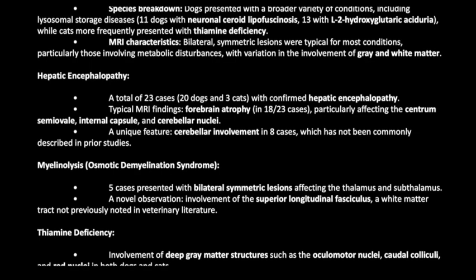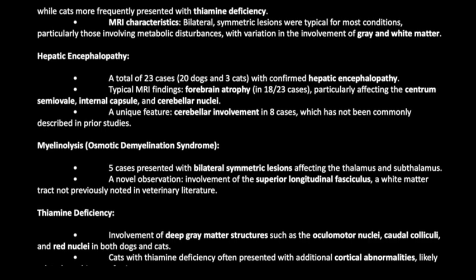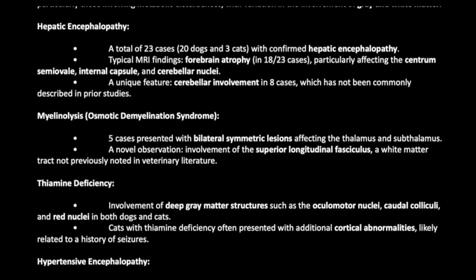Myelinolysis, osmotic demyelination syndrome. 5 cases presented with bilateral symmetric lesions affecting the thalamus and subthalamus. A novel observation: involvement of the superior longitudinal fasciculus, a white matter tract not previously noted in veterinary literature.